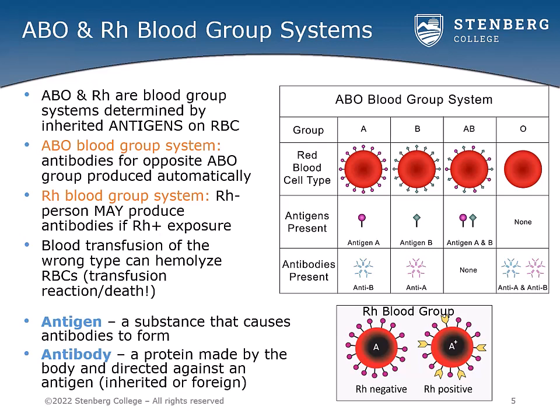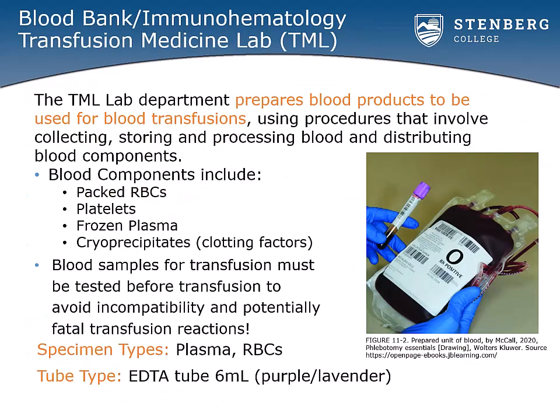This brings us to the purpose of the next lab department we'll be discussing, which is the blood bank, or immunohematology, or transfusion medicine lab. These are all the same department, just 3 different names. This department prepares blood products to be used for blood transfusions.